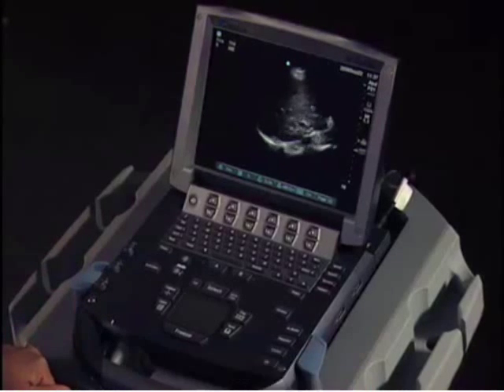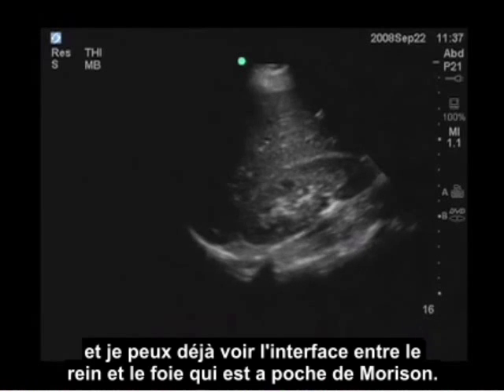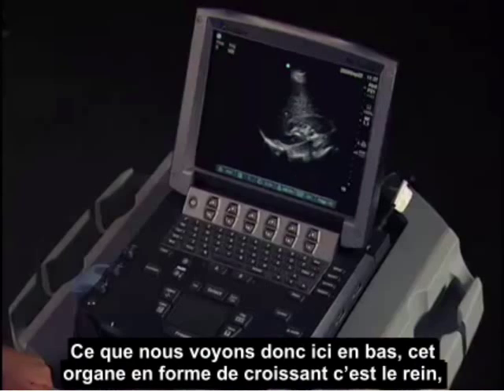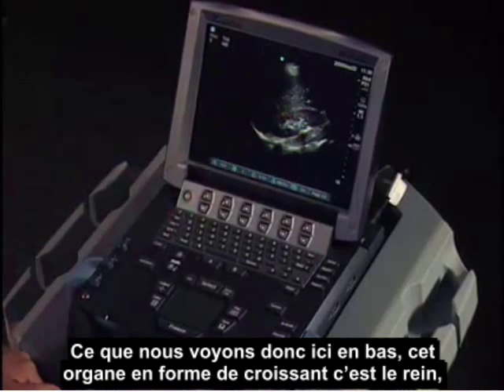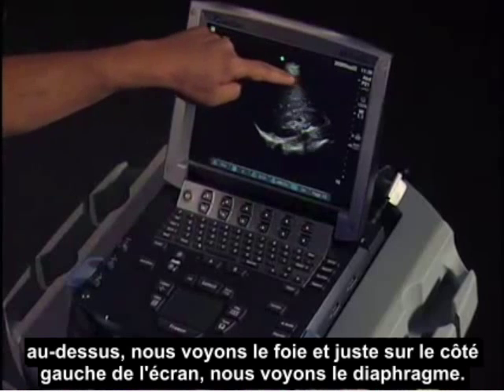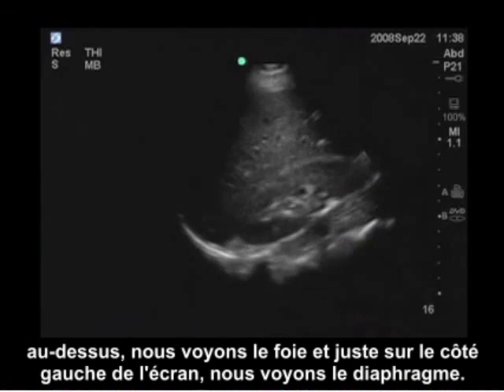I'm just adjusting my gain here. Already I can see the interface between the kidney and the liver, which is Morrison's pouch. On the bottom, this crescent-shaped organ is the kidney; above it we see the liver, and just to the left side of the screen we see the diaphragm.